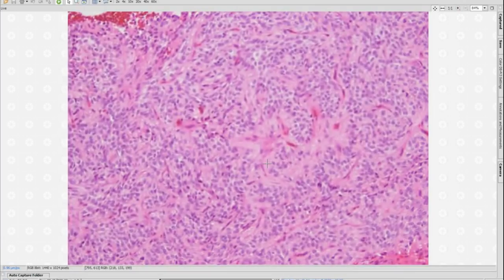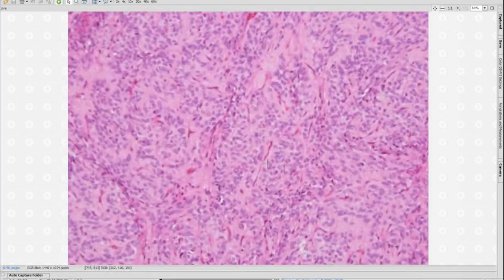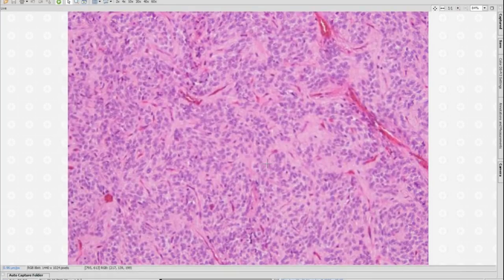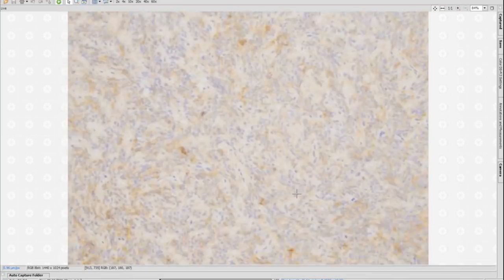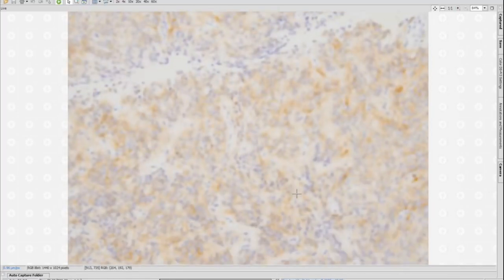Actually, here more of these cell processes around vessels. More of that, and more very well developed pseudo-rosettes actually suggest ependymoma, and in any location, you can have it in many different locations. So, of course, you do the stains. This was the synaptophysin. We show a very weak staining. As I mentioned to you earlier, the adenomas tend to be uniformly and strongly positive for synaptophysin in almost all cases. So you have here a little bit of trace synaptophysin that's non-specific.